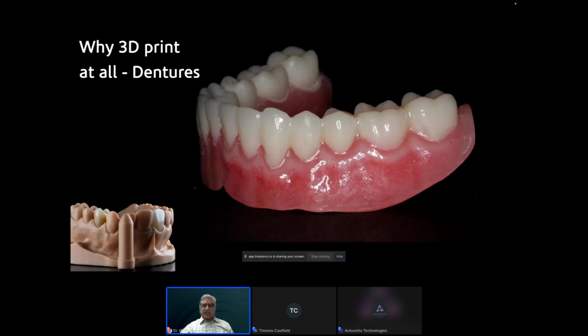And you can see how we've beautified, if you like, the denture base using GC Gradia resin and a few other colors from GC's OptiGlaze system. You can make a denture look reasonably pretty by using some of these materials. Obviously, the material is totally polishable as well, and we do that as well.